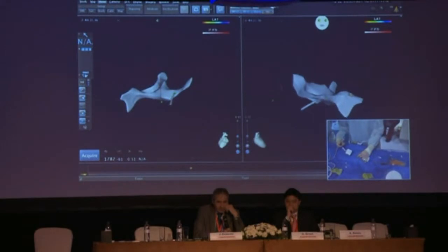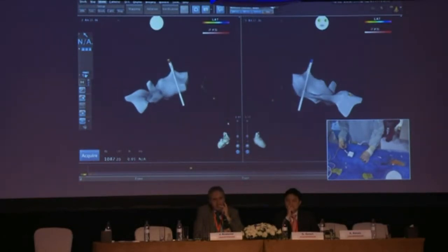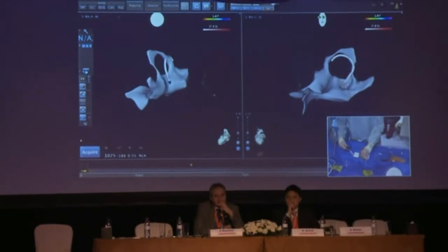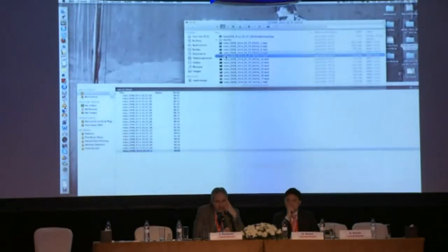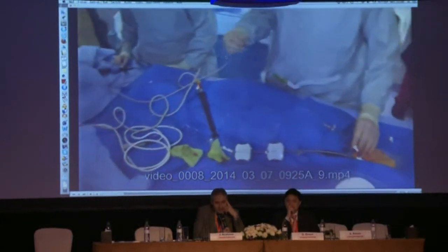Now I'm using the anatomical markers of the CS and the His, so I'm not using X-ray, but I'm also looking for knock on the mapping catheter where it's touching the metal of the transeptal needle, which, remember, is blunt. I've got the sharp bit inside. And here I am sliding it through alongside the transeptal needle, so that I am through the intraatrial septum and into the left atrium. That was the LAO view. So we've now crossed the septum with both our needle and our ablation catheter.